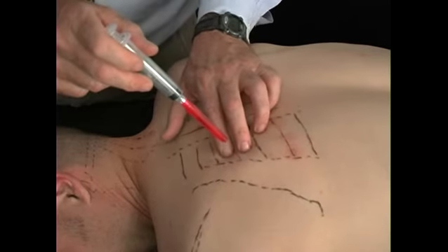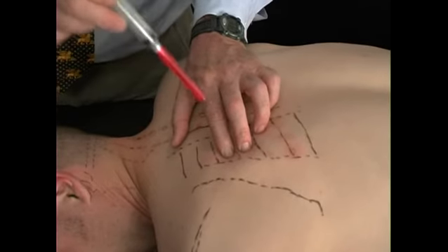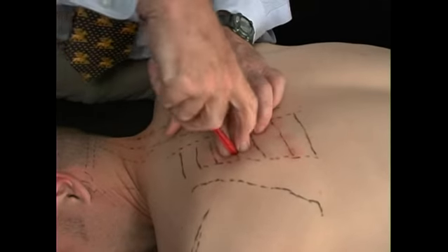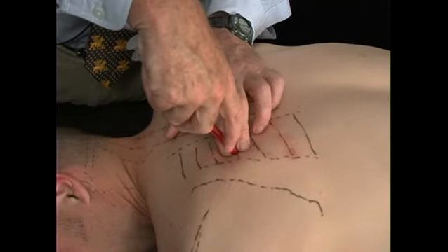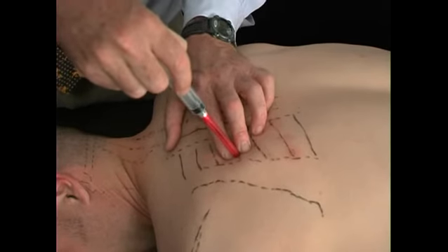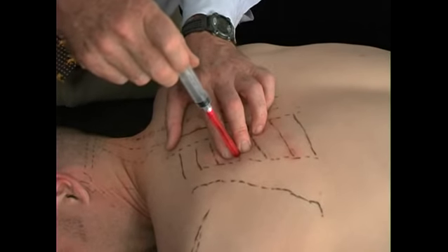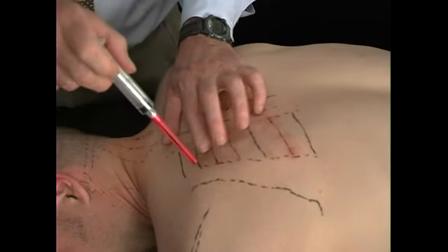When we do this rib that we can feel the depth on and feel the rib with a skin compression down, going back in, we watch how deeply the needle goes. You get used to doing this, just kind of mentally marking how deep that is. And so once you've found that point, how deep the needle is, you don't want to exceed that depth with your next injection up here.